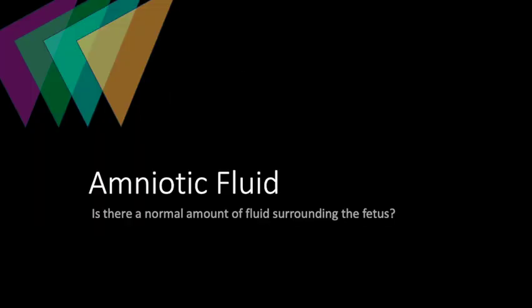So if we do indeed have a singleton gestation, we can go on assessing some of the other findings in second and third trimester. If there is a multiple gestation, I would recommend that we not do those and send those off for formal studies just because of the complexities with managing two fetuses and finding those measurements. However, if it's a singleton pregnancy, the next step is looking at the amniotic fluid and assessing to see if there's a normal amount of fluid surrounding the fetus.